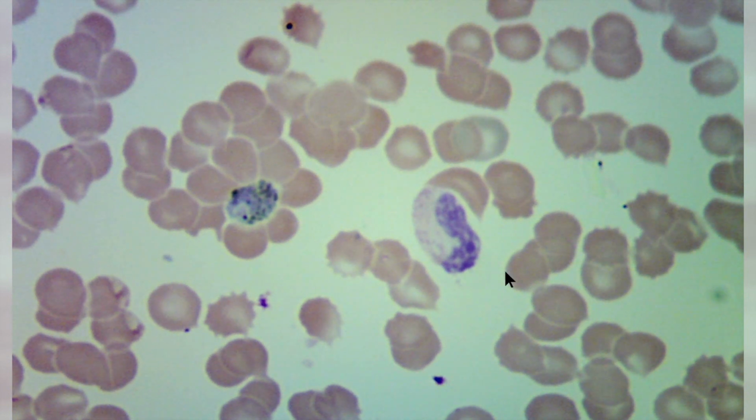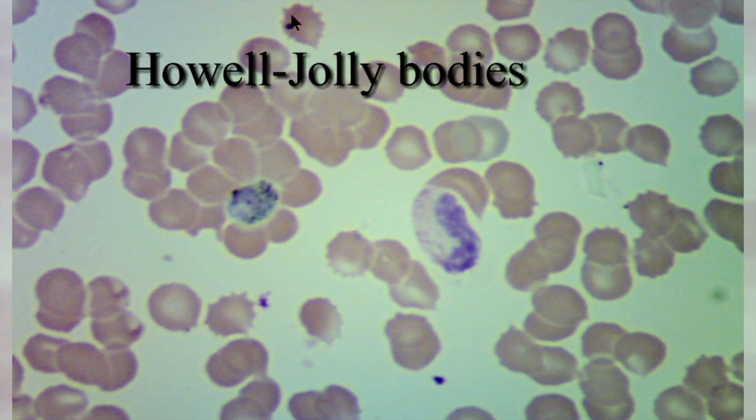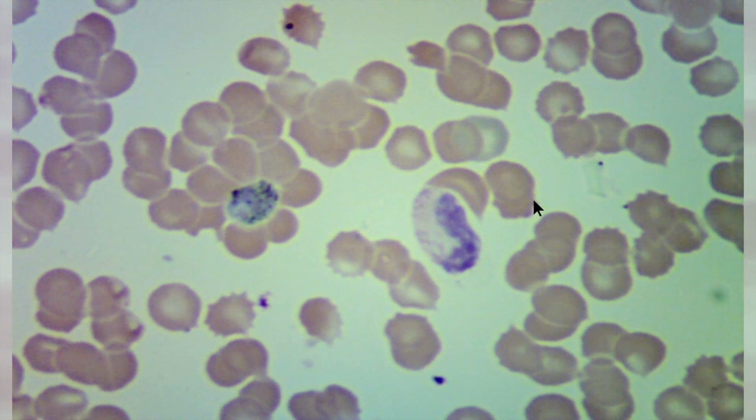Platelets appear to be normal. There are artifacts around the field. They may not be artifacts actually, because up here I denote Howell-Jolly bodies in the red blood cells. So they may be the remnants of those Howell-Jolly bodies. That's a possibility.